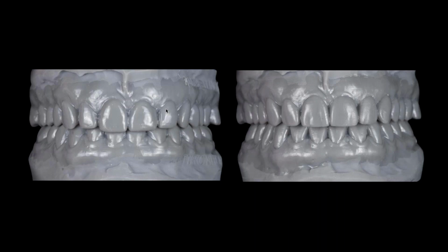But here's why I like it. When you send a patient their pre-op models, and they're in white or yellow or peach stone, and then you send them a digital model or another stone model with wax on them, they don't really get the concept because the wax doesn't make sense to them. It's our world, it's not theirs. But when I send them two sets of plastic models, one of them the before and one of them the after, it really makes a lot more sense for them. They kind of understand, this is what my teeth look like now, not thinking about material, and this is what they can look like after.